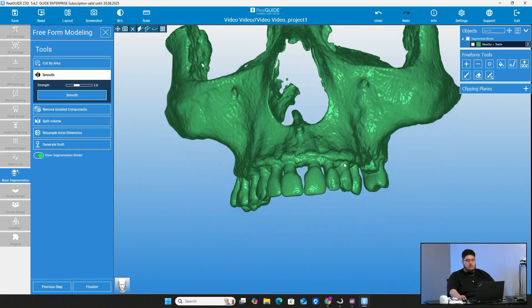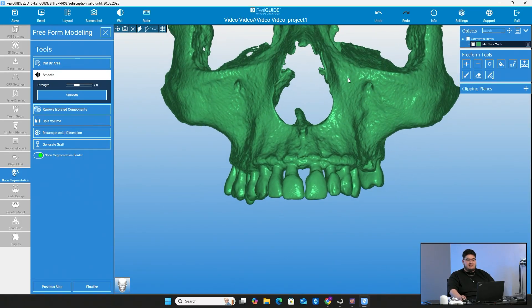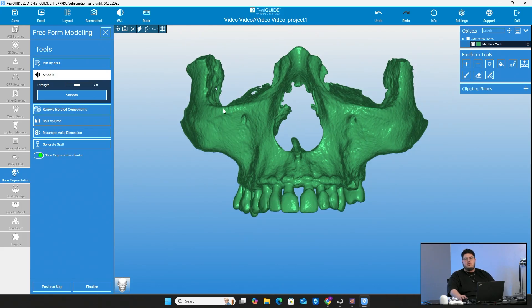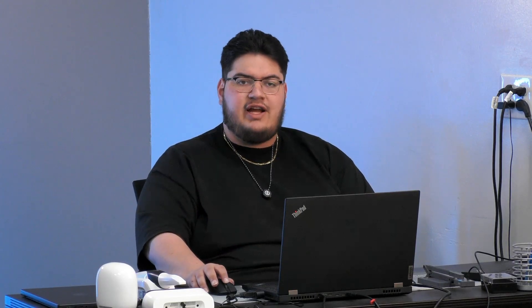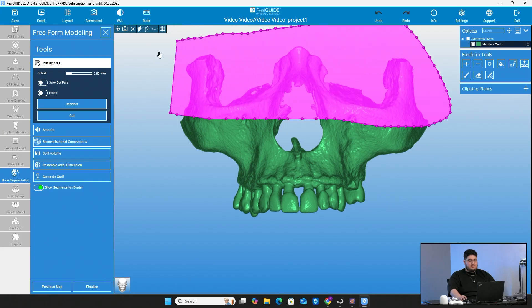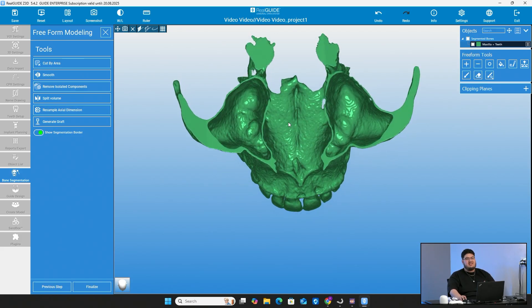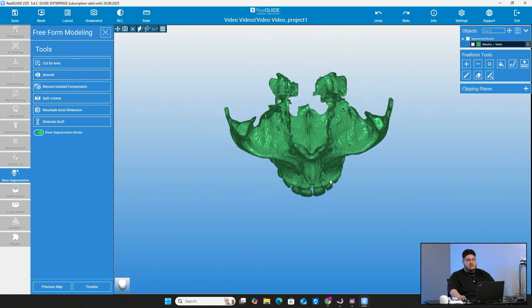Here we have our bone model. You can actually take this now because it is an STL object — it's no longer in DICOM format. You can export it out of the software and print it on your printer. As you probably noticed, there is a lot of material, so if you were going to print this, it would take a lot of resin. You can go to the cut area and start taking away any extra material you may not want. The bigger the object, the more material you'll use and the longer it'll take to print.